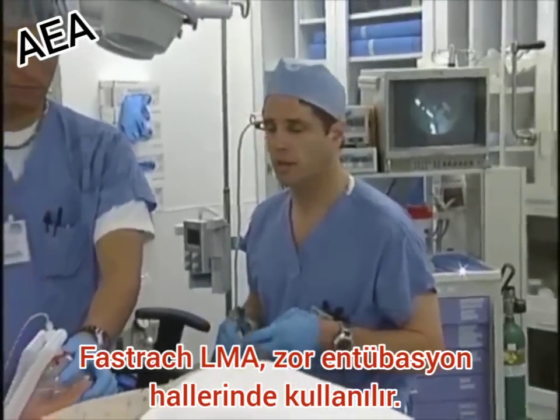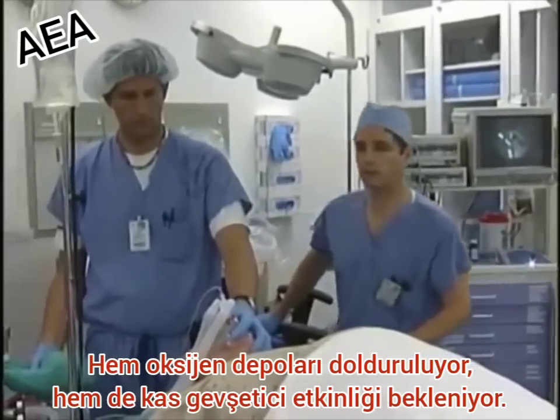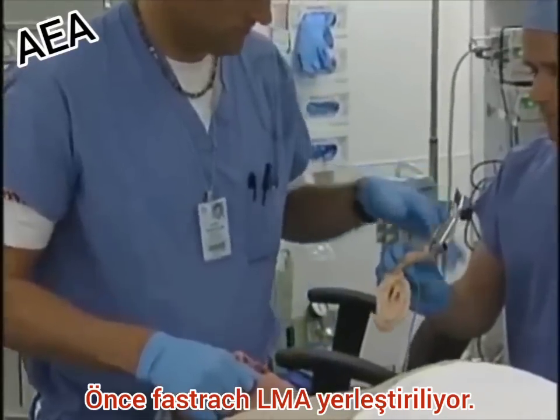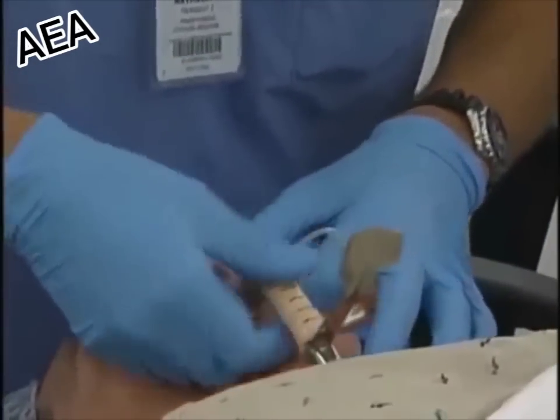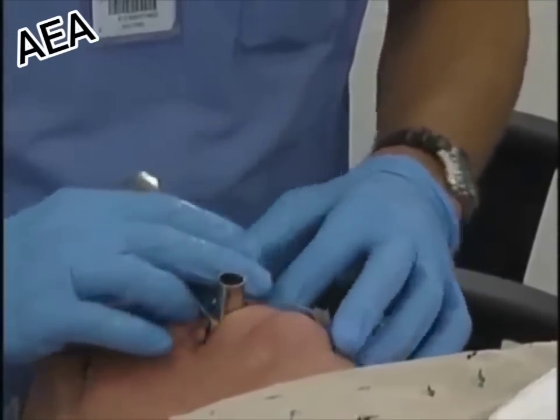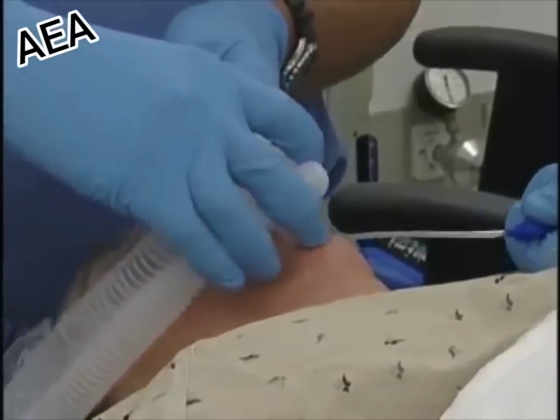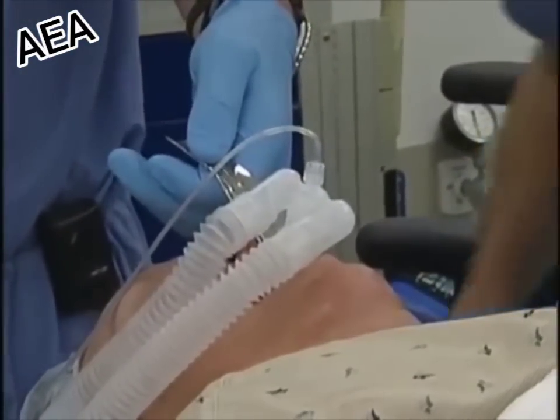Field is ventilating her with a mask and she has adequate anesthesia. She has muscle relaxant on board and we're going to put in the LMA now. It's an LMA5, the largest size. Looks like it's seating well. Put in 40cc's of air. We're going to check for our leak.